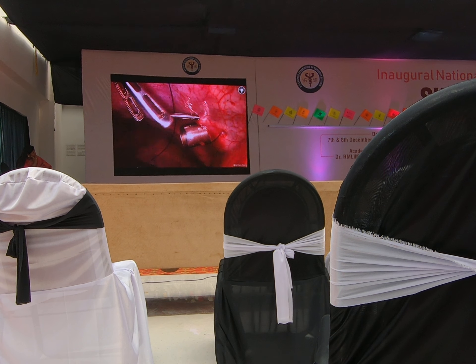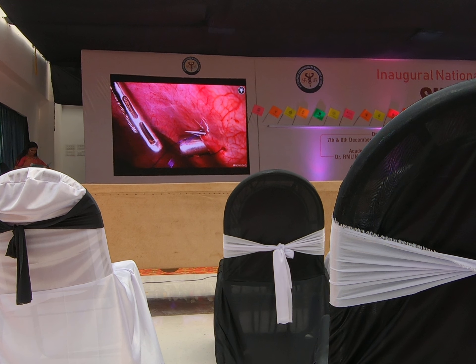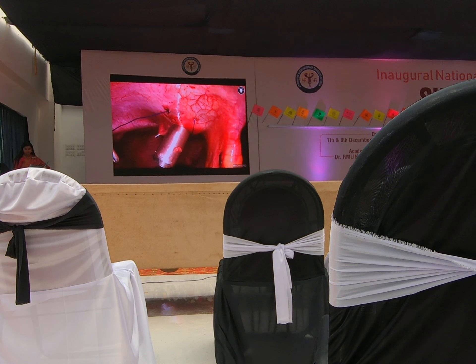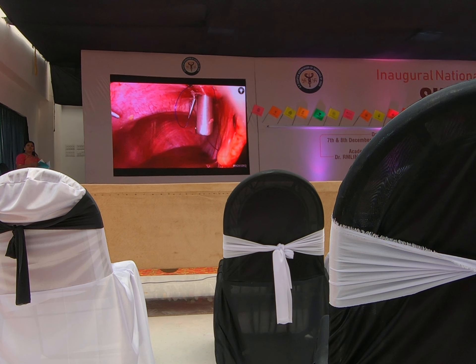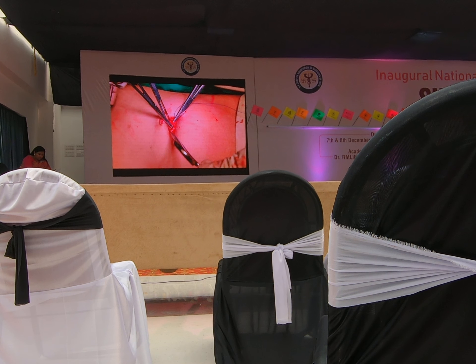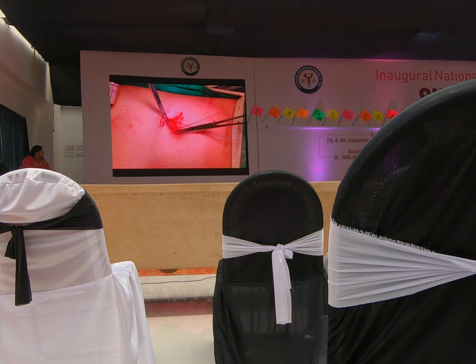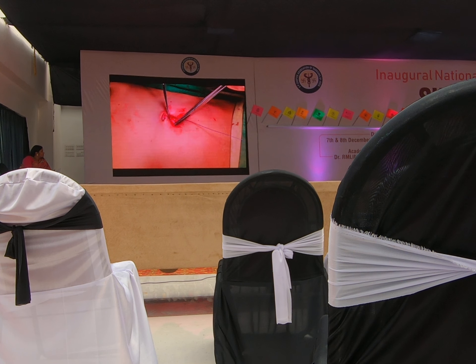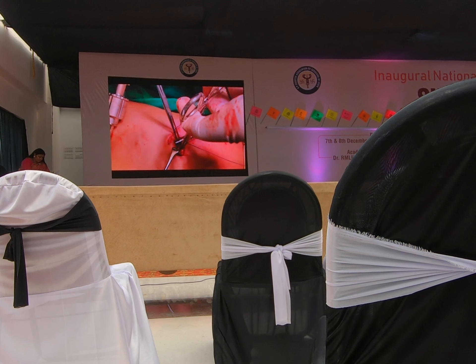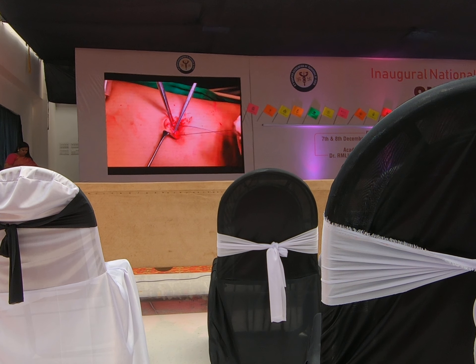You repeat it on the other side because this is a 10-millimeter port. This is happening to the port incisions in the epigastric. In essence, you now have two sutures along the epigastric port, but don't pull out the port just yet. Remove your camera port instead, which is in the umbilicus. We use two Allis forceps to grasp the suture really well. The assistant plays a very vital role, holding the two forceps and the hemostat to catch the tip of this short, stout needle, ensuring it does not disappear into the abdominal cavity.